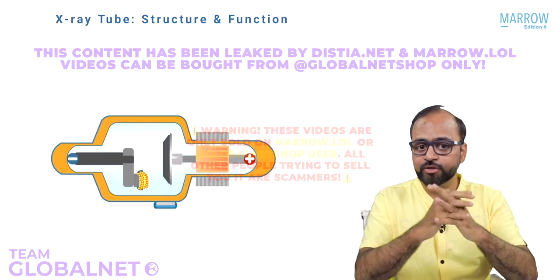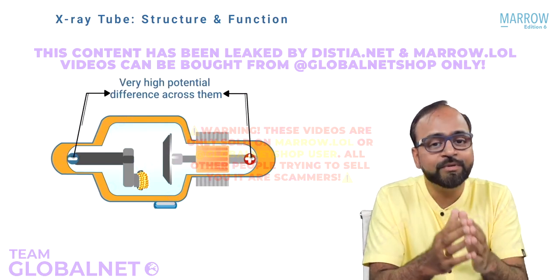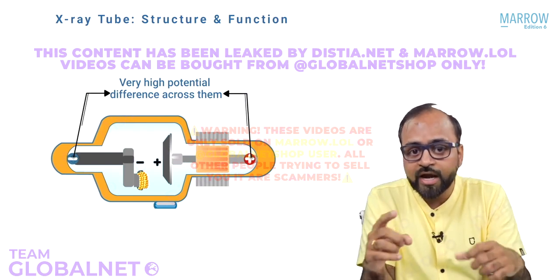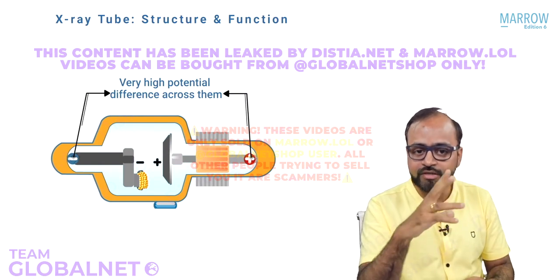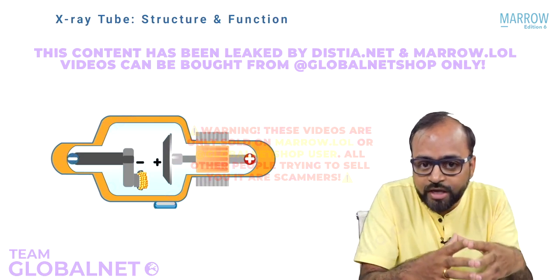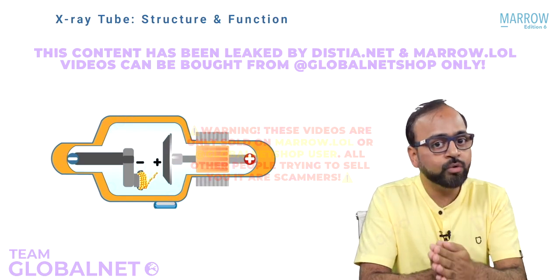Do you realize that inside the tube there is vacuum, and I told you there is a very high potential difference which is applied between the cathode and the anode. The cathode is very negative, anode is very positive, and we know that opposite charges will always attract. So what will happen to these negatively charged electrons? These negatively charged electrons which are accumulated as a cloud of electrons around the cathode filament will naturally be attracted towards the anode.